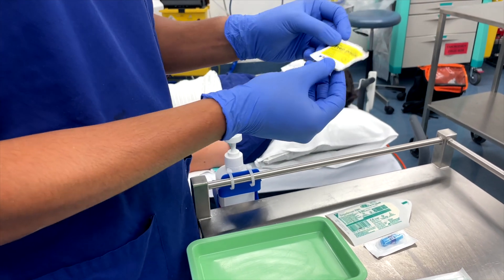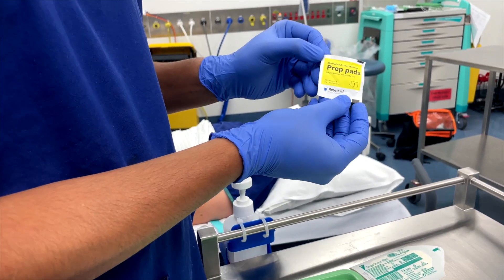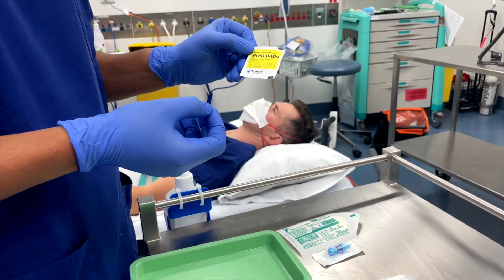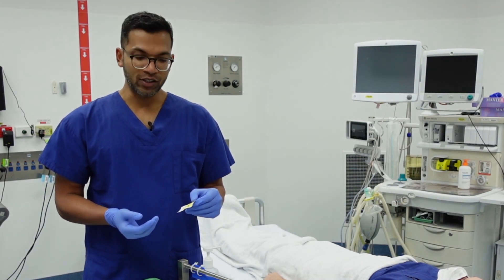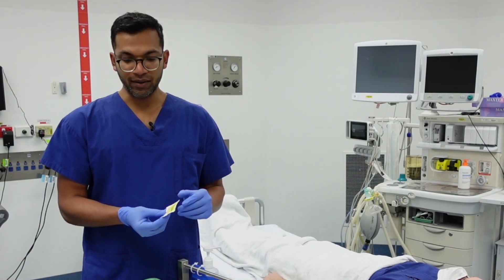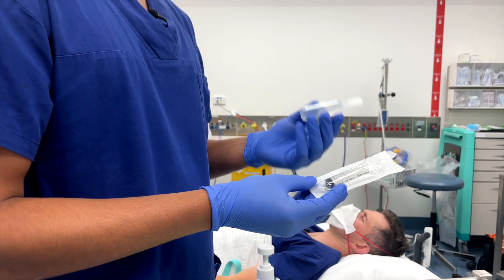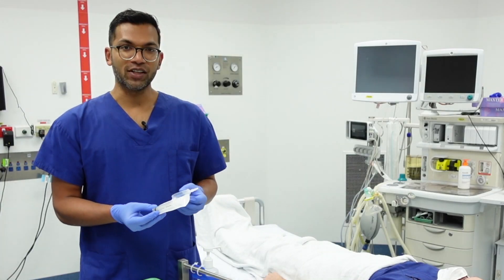I make sure I have some kind of prep solution to disinfect the skin — this is an alcoholic chlorhexidine prep. Just know to be careful with chlorhexidine as it's a relatively common allergen, so I always check with the patient if they have allergies before putting it near them. Finally, once you place the cannula you really want to make sure it's in, so I usually use a saline flush in a 10 ml syringe to flush the cannula and make sure it's working well.